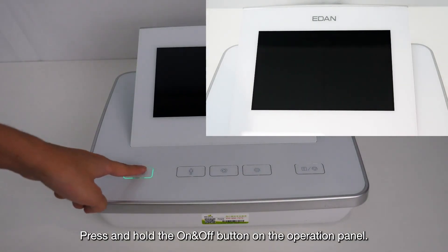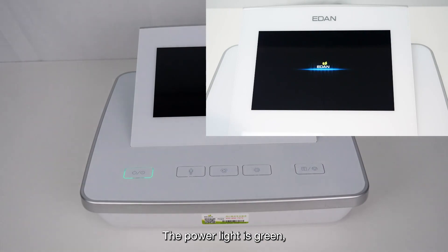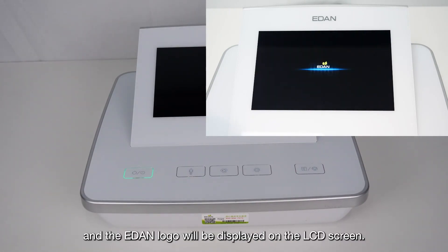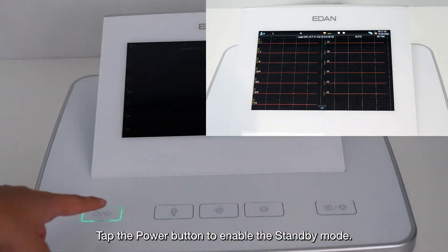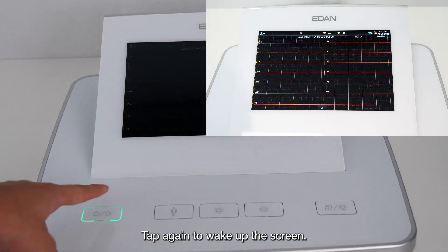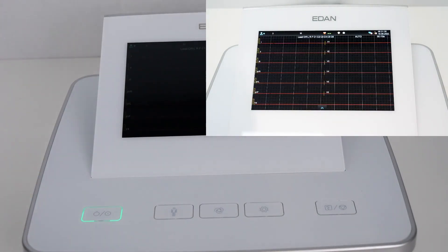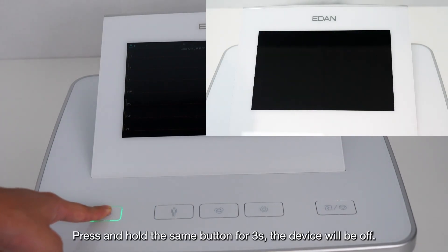Press and hold the on/off button on the operation panel. The power light turns green and the EDEN logo will be displayed on the LCD screen — the device is ready for use. Tap the power button to enable standby mode; tap again to wake up the screen. Press and hold the same button for three seconds to turn the device off.